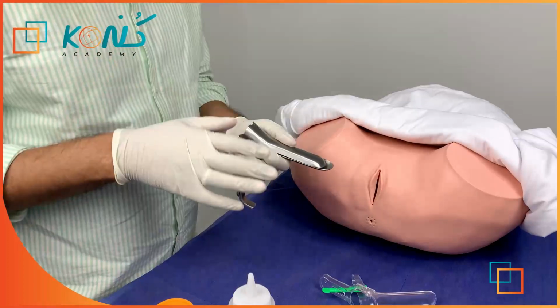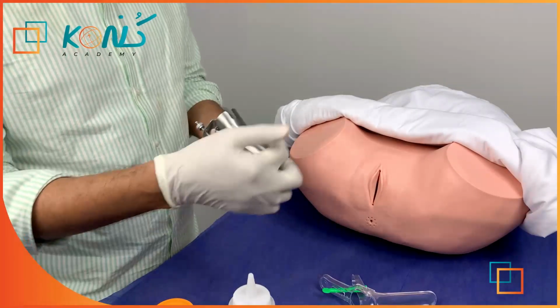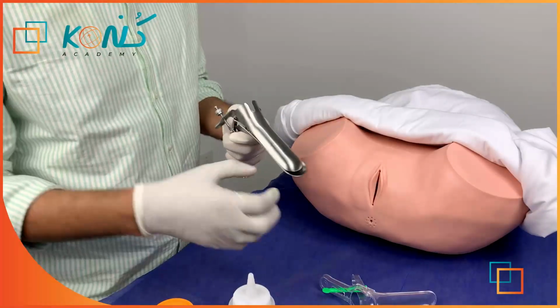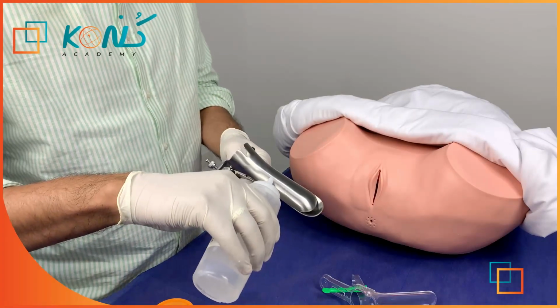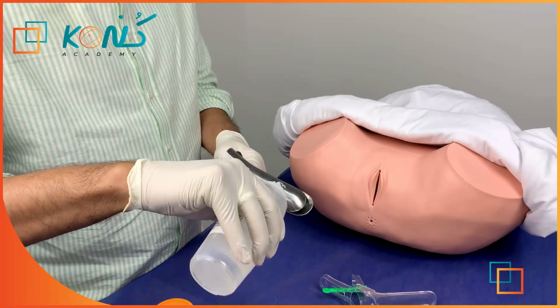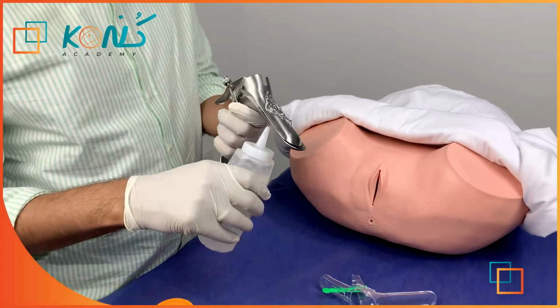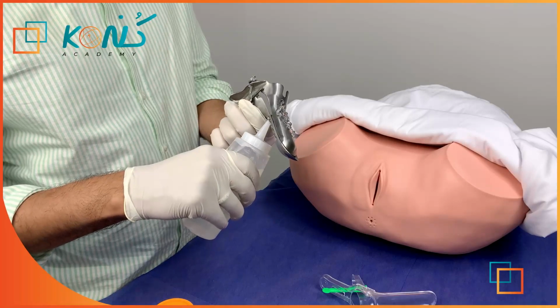But if you should use lubricating gel, try to avoid the tip. There are special types of gel you can use just to lubricate these sides here. Okay? And also to lubricate these sides. Okay?